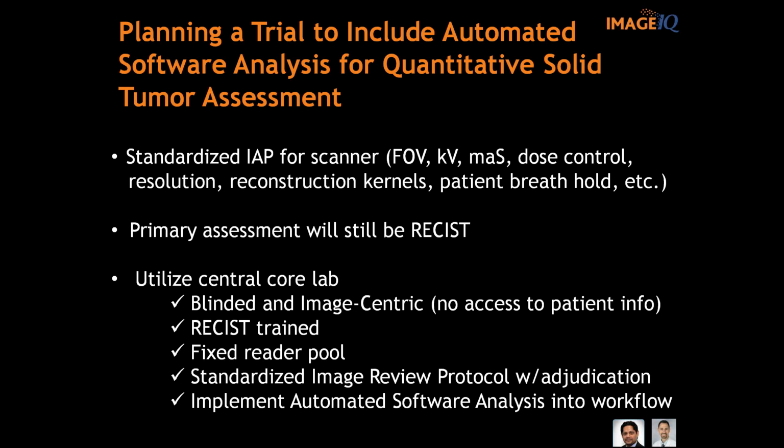And then you also want to make sure that you're monitoring any sort of variability that you would get, and it's much easier to do that at a centralized site than across multiple sites that are doing their own reads. But you want to flag any weird deviations from reader to reader to make sure that no site is doing it incorrectly or deviating from the protocol.